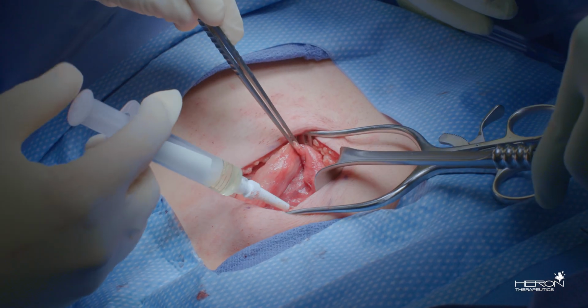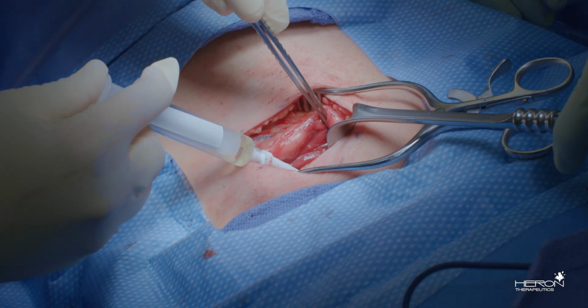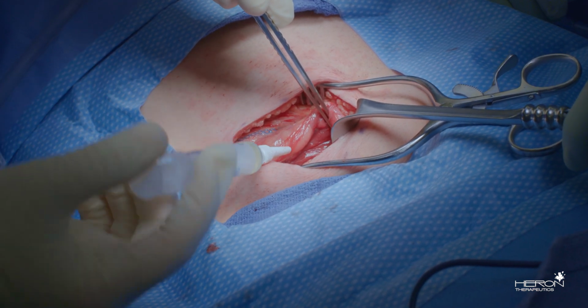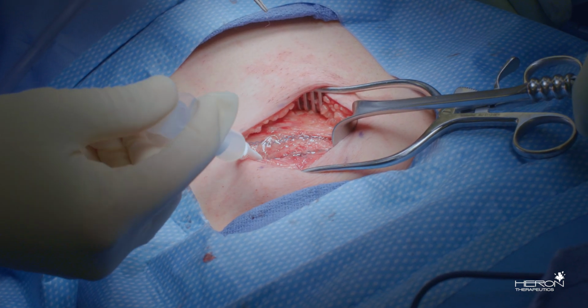The product is a viscous liquid, light yellow and sticky. It's applied to the surgical site with a syringe and a luer lock tip. There's no needle. It's helpful to put on a second pair of gloves before application of the product and then to remove those gloves before the skin closure.